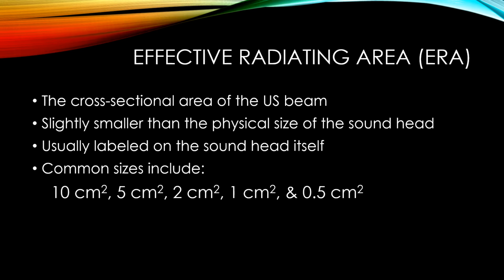The ERA is usually at least slightly smaller than the physical size of the sound head, because the piezoelectric crystal has to be mounted or contained in that sound head or transducer. And so the actual sound head that touches the patient is going to be a little larger than the ERA. The ERA is also usually labeled on the sound head or on the cord that is connected to the sound head. And there's a variety of sizes.